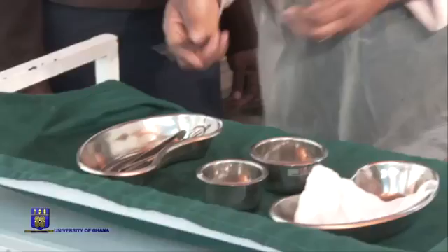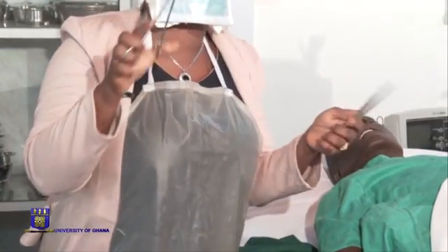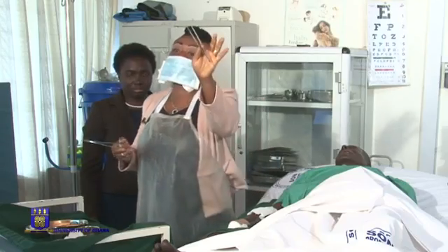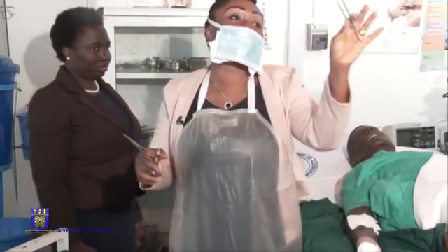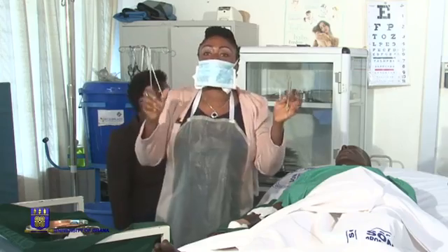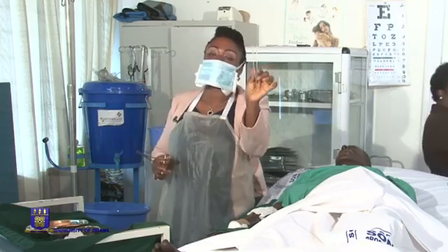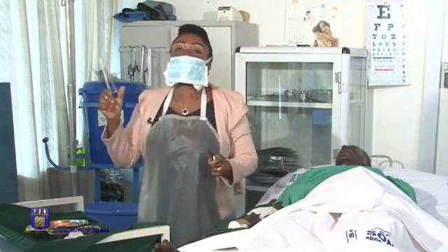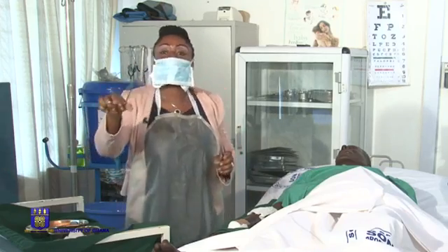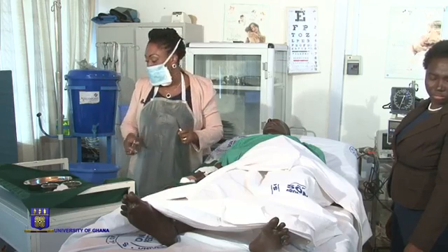We have a dissecting forceps and an artery or the dressing forceps which is going to be used in dressing the wound. The dissecting forceps in this case is seen as the sterile or the clean forceps because that is not coming into contact with the wound. So you pick the swab with the dissecting forceps, and then you dip in the lotion, squeeze it, and arrange the swab nicely on the dressing forceps and dress the wound.